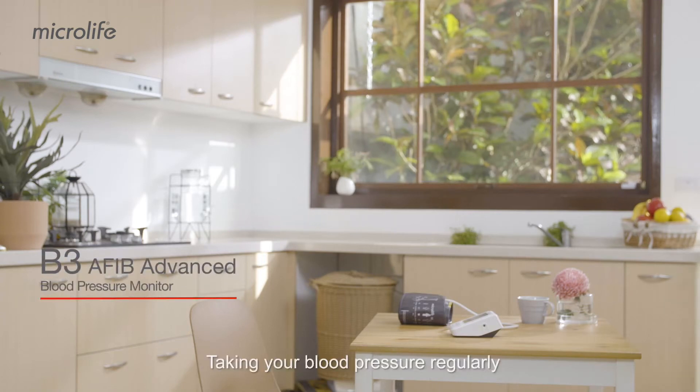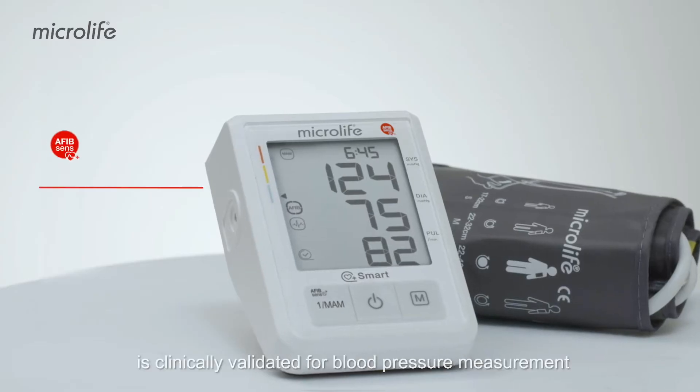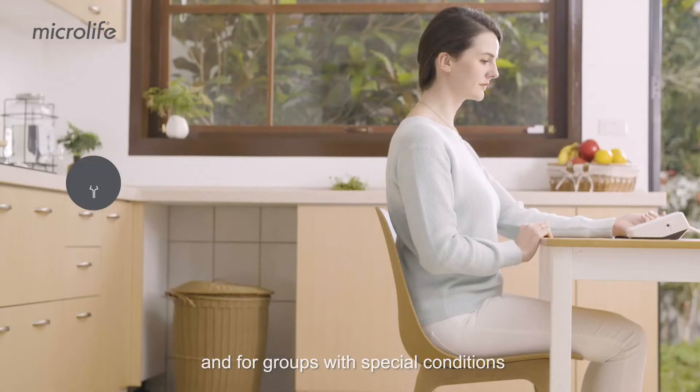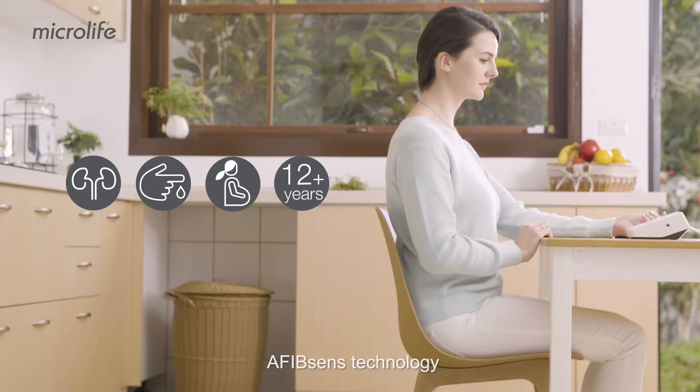Taking your blood pressure regularly can help get your blood pressure under control. Microlife B3 Afib Advanced is clinically validated for blood pressure measurement in the general population and for groups with special conditions, and can detect atrial fibrillation with Microlife's clinically proven AfibSense technology.